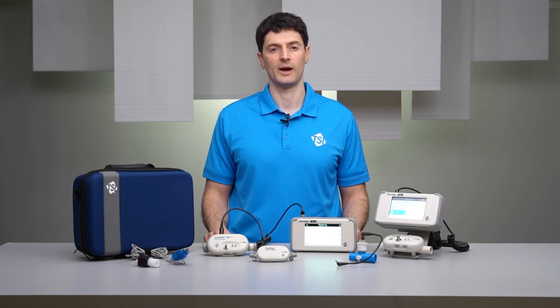TSI Certifier Flow Analyzers are used by biomedical departments, med device manufacturers, and service organizations to repair, calibrate, or perform preventative maintenance on ventilators, anesthesia workstations, and other respiratory medical equipment.